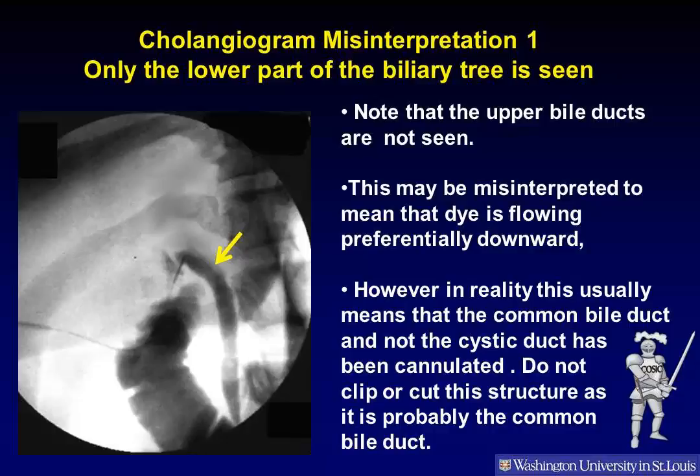Cholangiogram misinterpretation 1: Only the lower part of the biliary tree is seen. Notice in this cholangiogram that the upper ducts are not seen. This may be misinterpreted to mean that the dye is flowing preferentially downward. However, in reality, this usually means that the common bile duct and not the cystic duct has been cannulated.